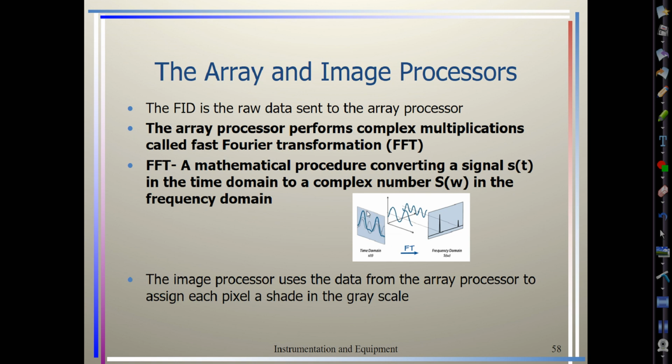So you can see here how we're receiving these sine waves with that receiving coil. And that's over time. So we have signal that has a positive pulse, a negative pulse. That's how we get that sine wave. And you think about it, that's because that's that vector in that transverse plane that's rotating around 360 degrees. So that's why it looks like that. And that's over time.